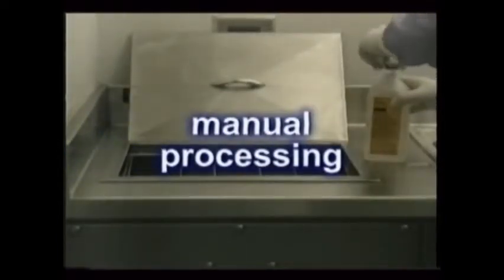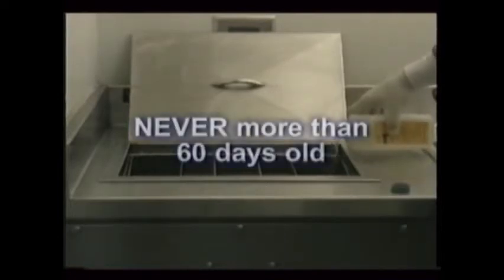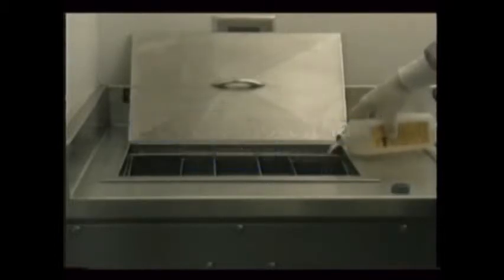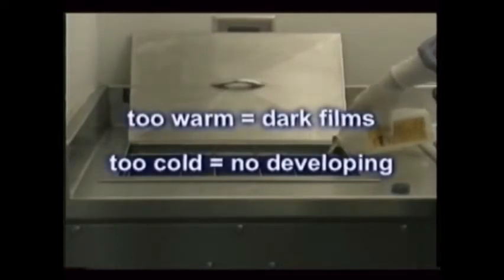Manual processing is still used, even if maybe not in your office. The dip tank can serve as a backup to the automatic processor. Its chemicals must be fresh, like in automatic processors, and never older than 60 days by law. They must be used at the correct temperature. Too warm, and they turn films dark very quickly. Too cool, they won't develop at all.